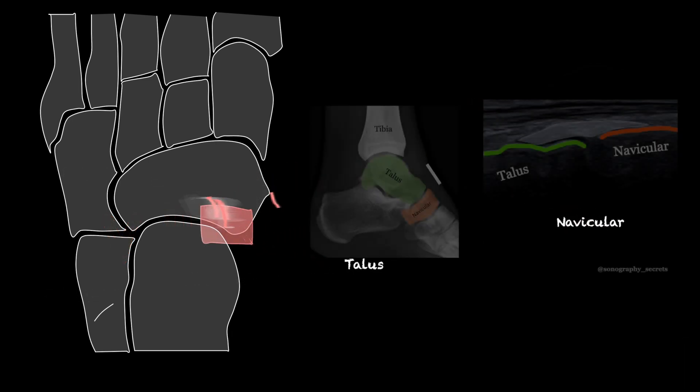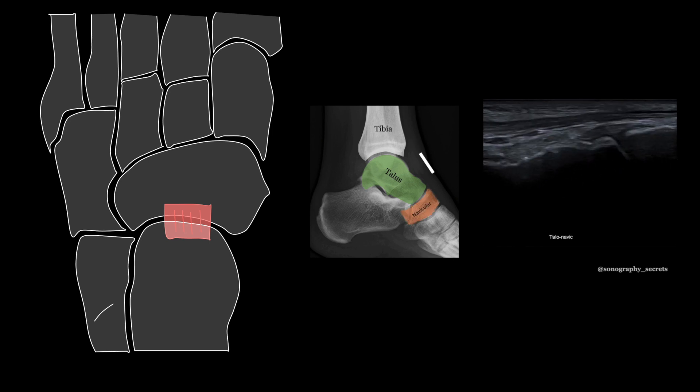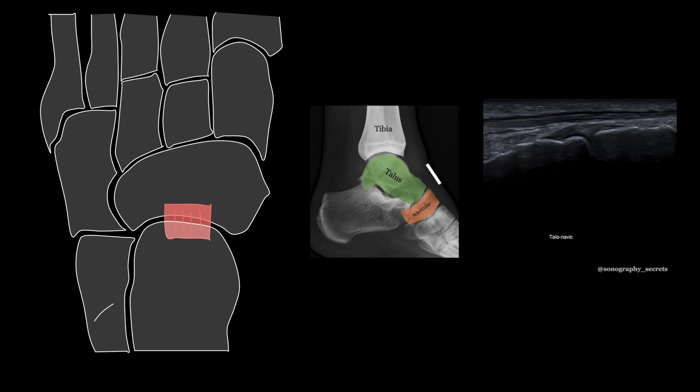To identify the talonavicular ligament, I start from the anterior ankle joint and move the probe towards the great toe. We'll see the talar dome, talar neck, and the next bone we see is that of the navicular.